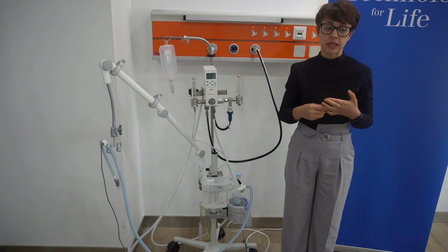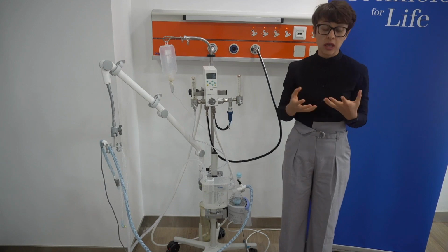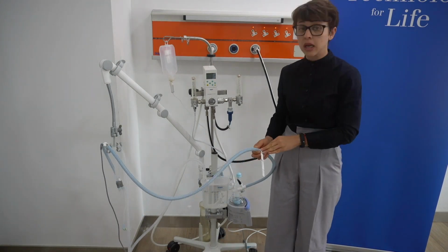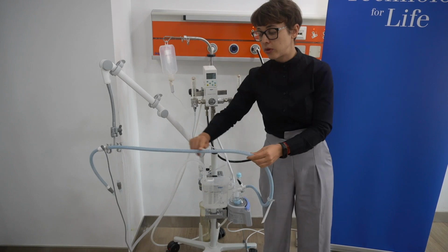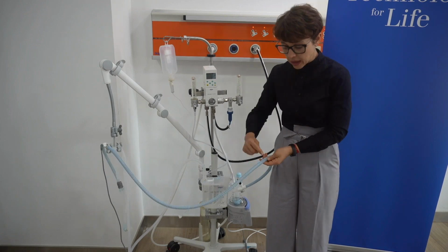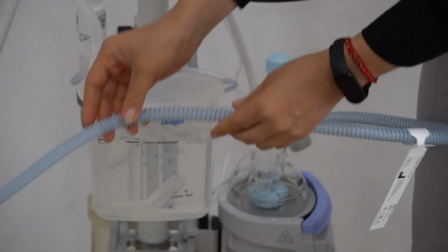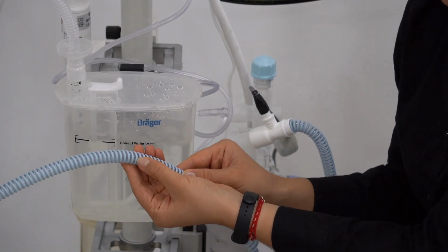CPAP system. So Linda has mentioned that on the inspiratory side, it is important and better to have a circuit that supports the warming of the air. So here we have a heated inspiratory circuit. We see the heating element, this blue line, in close proximity. The blue line of the circuit is actually the warming element.